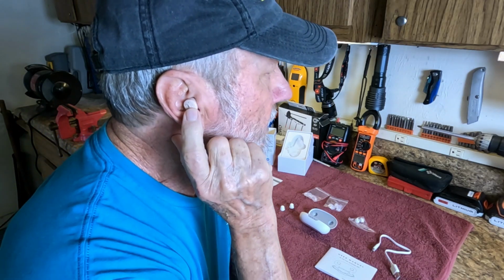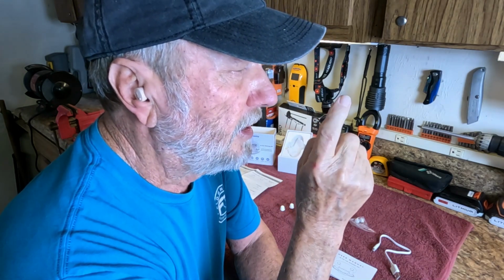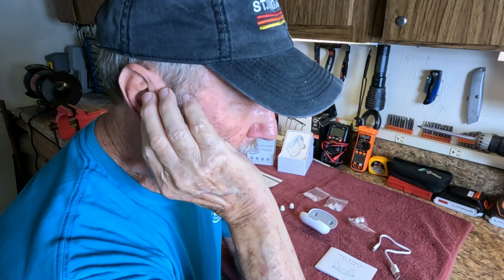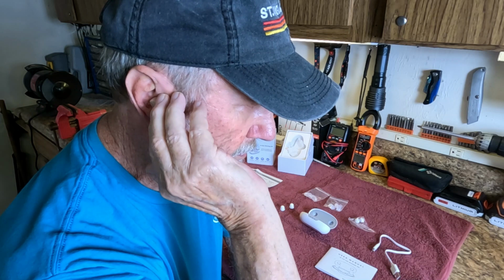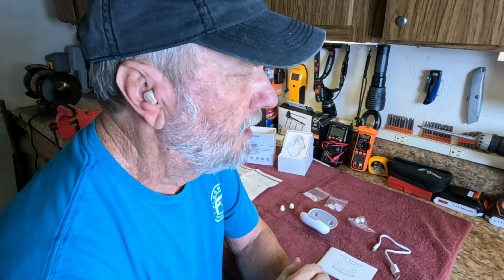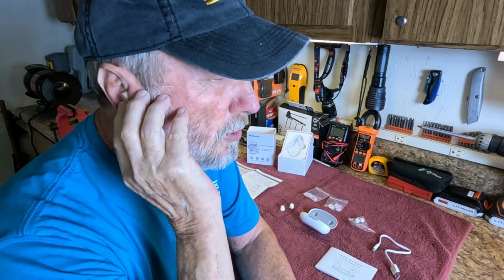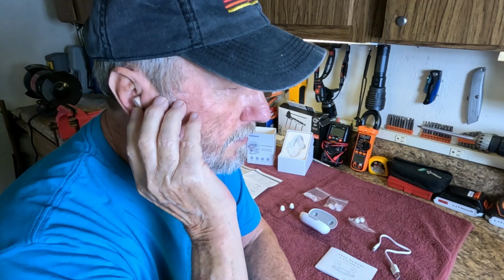Okay, I clicked on this real quick. Click, click. It's not click, click. It's click, click. And you have to kind of hold the one beep, two beeps, three beeps. Okay, this one's up at the highest level. I don't really need that, so I'm going to put it one more double click and it'll go back to level 1.